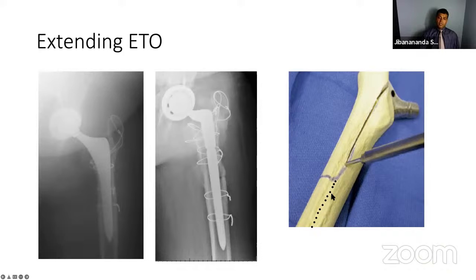Now be mindful that this split can go all the way down, so you have to wire it below the split where you want to stop the split. You need to make sure you wire it if you extend it.